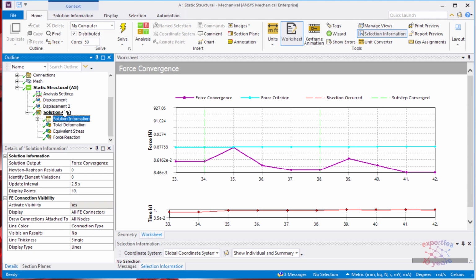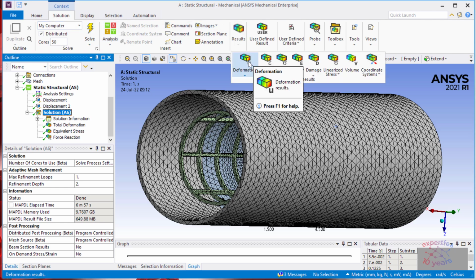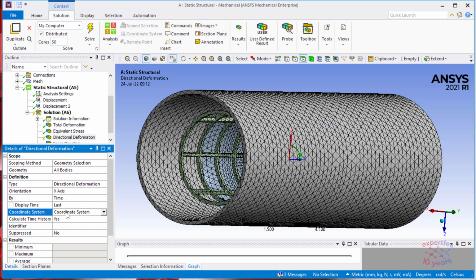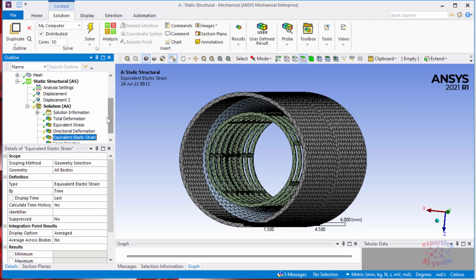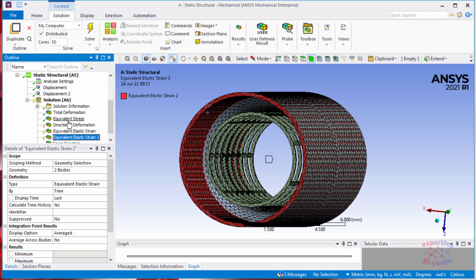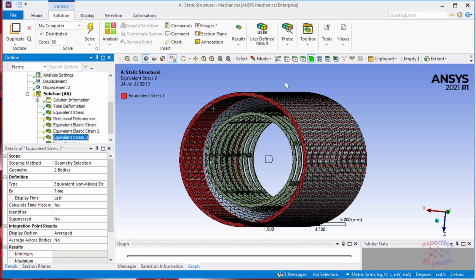We can minimize here. Let's assign more items. A directional would be interesting, and instead of the global coordinate system, let's choose the system that we created and choose this direction, the X. It is already here. Alright, then let's go for an elastic strain. I'm interested also in an elastic strain only in the so-called hyperelastic bodies, and I also want to see the stress only in these two bodies with control pressed, equivalent von Mises stress.